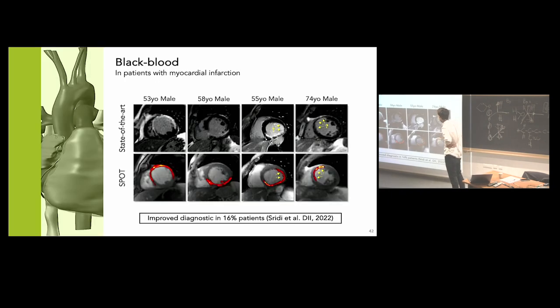I'll be quick on that, but you could see that this is very useful in the patients where the radiologists did not agree. For example, here we know that something's going on in this area. There's a thinning of the myocardium, but if I ask you all to segment the scar here, we will have 50 different segmentations. Not the case anymore.